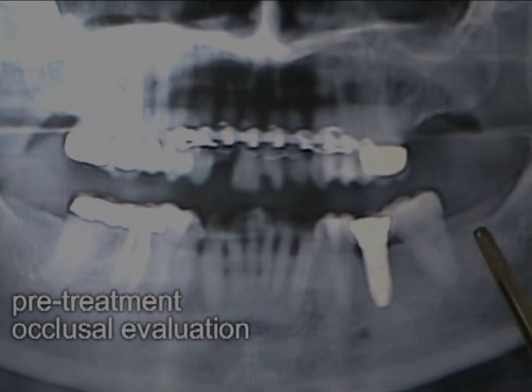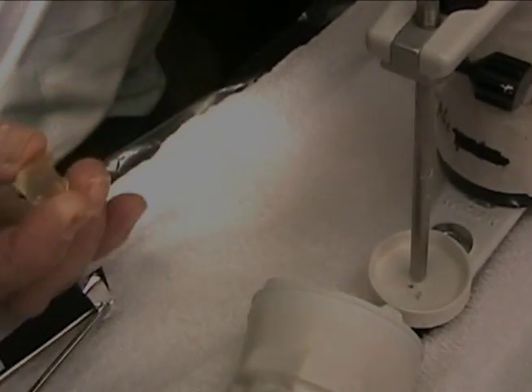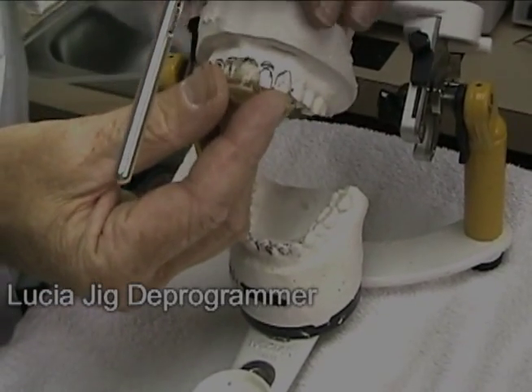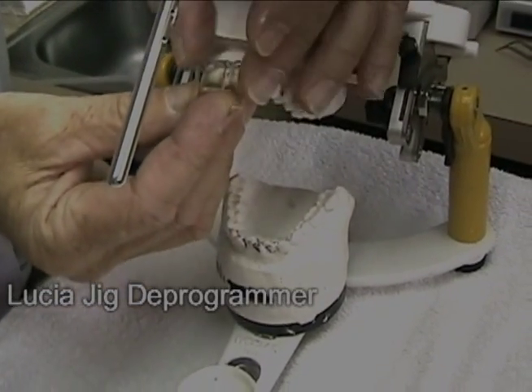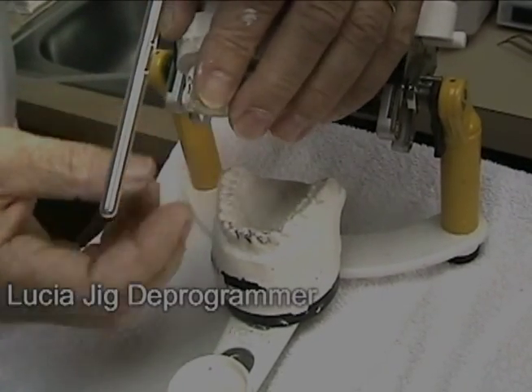We'll use a Lucia jig, which we have here. The Lucia jig, which you're familiar with in equilibration — we'll put impression material in this, put it over the teeth, and that will create an instant customized anterior deprogrammer for the muscles.